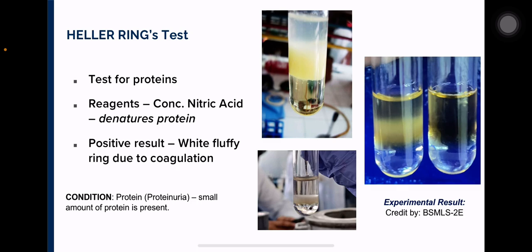So in an aqueous state, the hydration sphere that surrounds the protein becomes disrupted due to the charges. So the disruption brings about an imbalance in the structure of the protein, resulting in precipitation. So the addition of your acid to a protein sample causes precipitation of proteins at the point where the acid comes in contact with the protein solution.